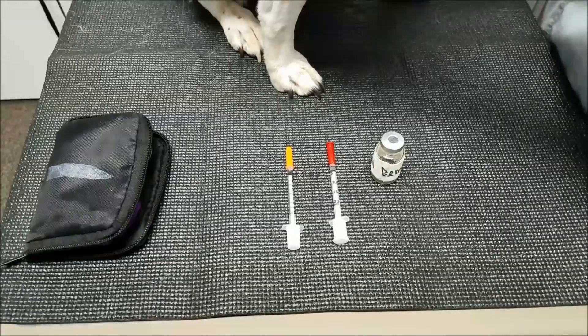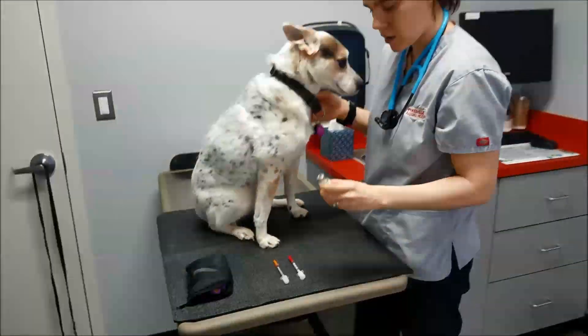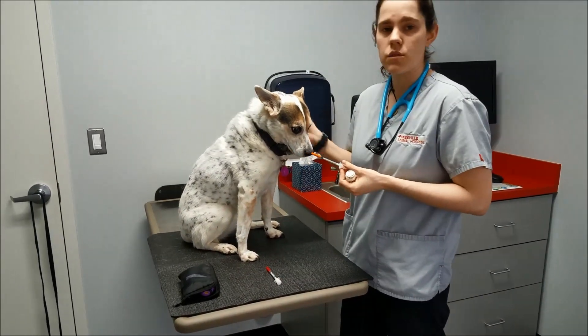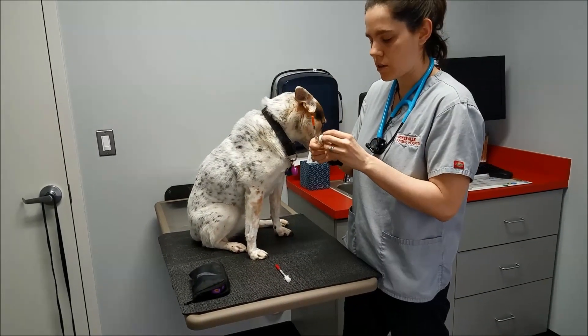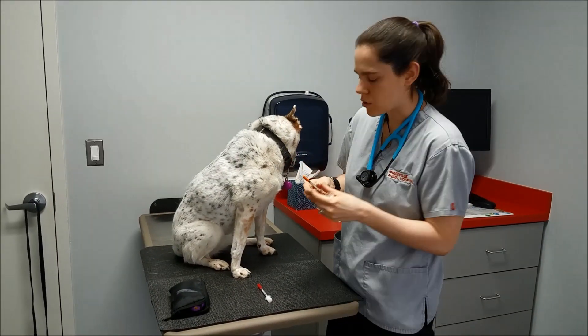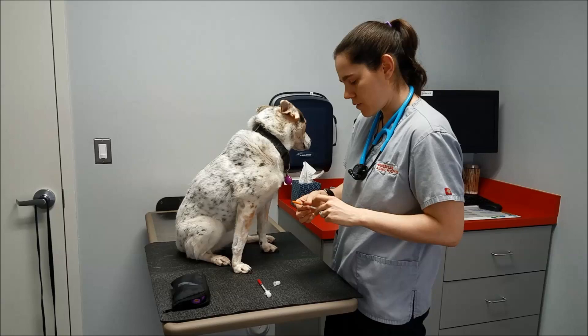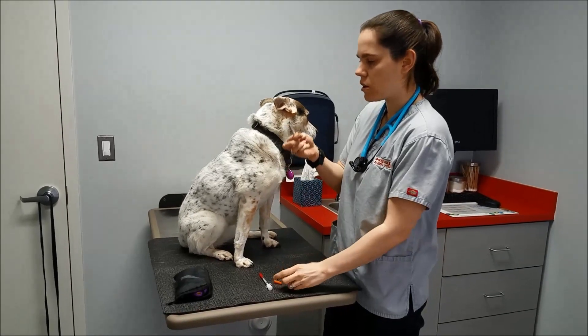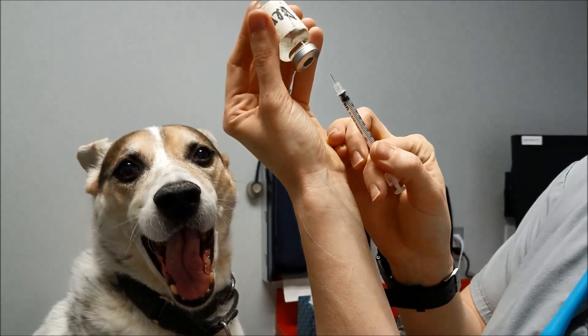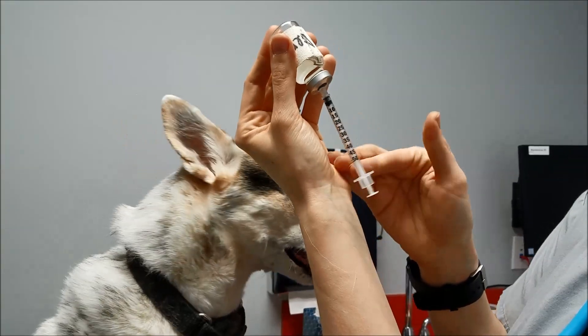What we're gonna do here — this isn't insulin, but it's representative of our insulin. She uses U100, so we have this here. This is basically our vial of insulin, which is right now sterile water. We take the little cap off the bottom. This is our needle here — it's very fine. You plop it in to the bottle there.